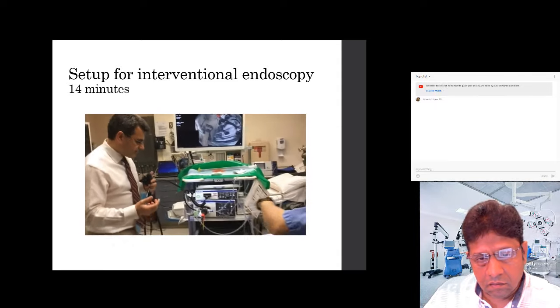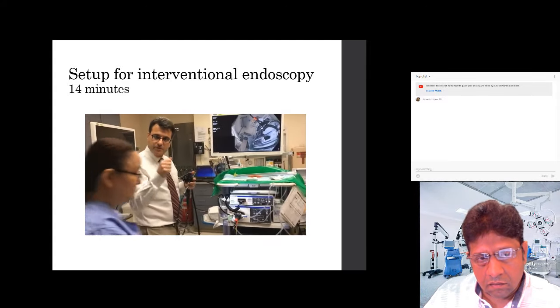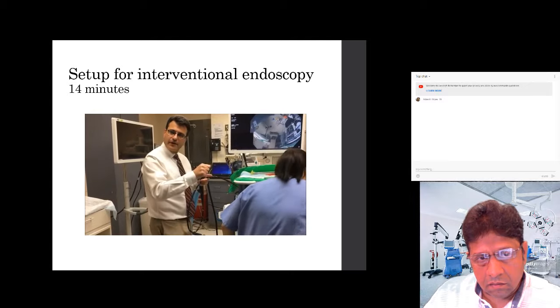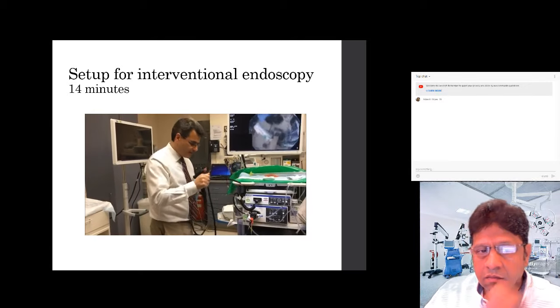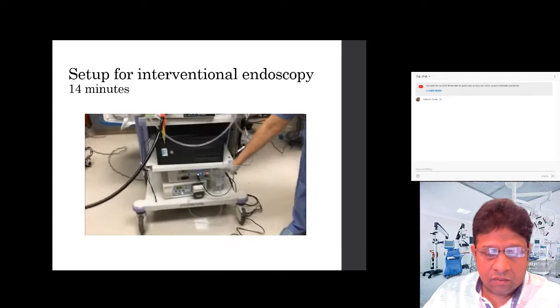So bicap is when you want to add heat, right? You want to use thermal cautery. You want to burn the area, push up against the vessel, and stop it. So I'll just let you know, that's when we're going to use the bicap.